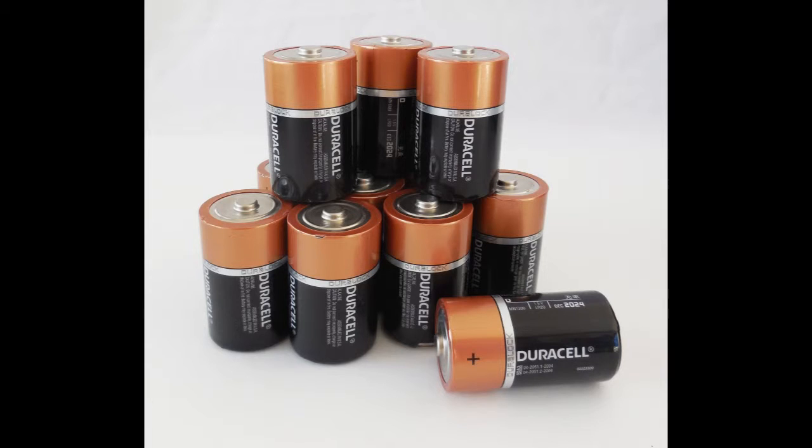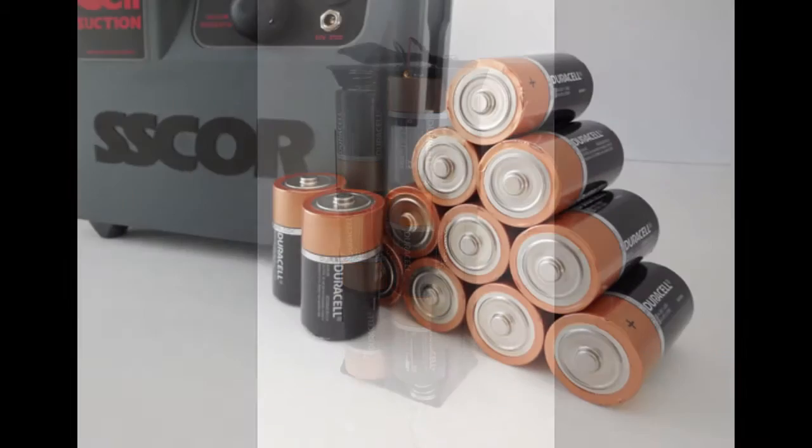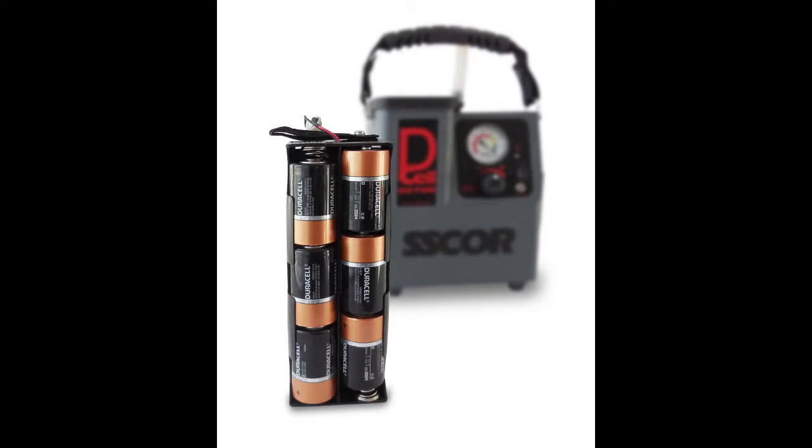The feature that makes the DCell suction truly unique is its use of DCell alkaline batteries. A battery pack containing 12 fully charged alkaline batteries at full capacity will power the device for approximately 6 to 9 hours. This runtime is defined as the period of time the device generates more than 300 millimeters mercury negative pressure. This runtime specification is based upon tests conducted using new DCell copper top batteries. Runtimes are affected by many variables, which include the brand of battery, the age of the battery, and the ambient temperature.